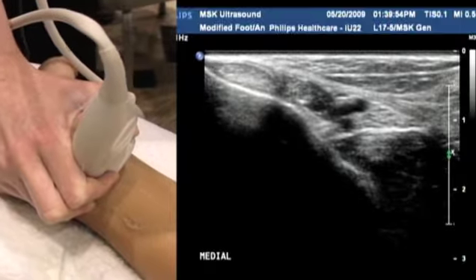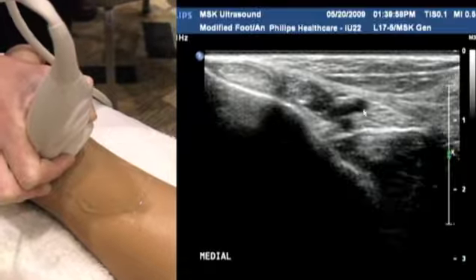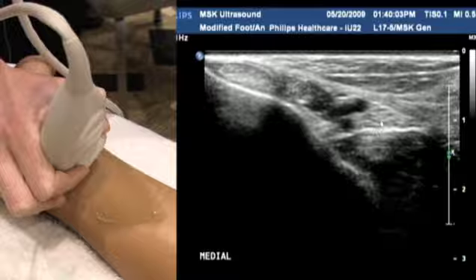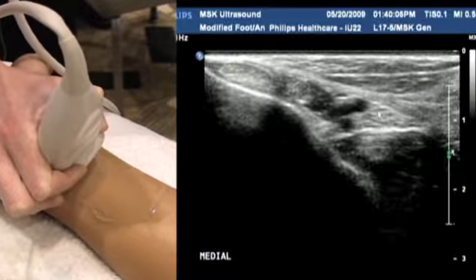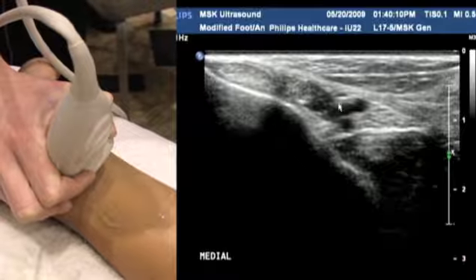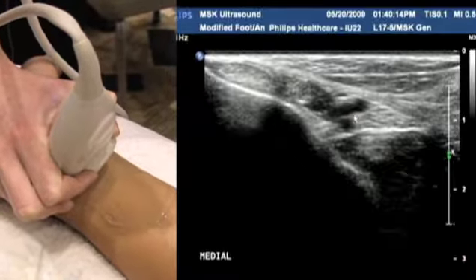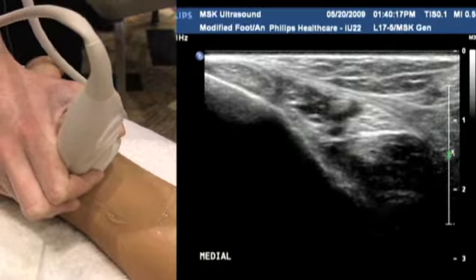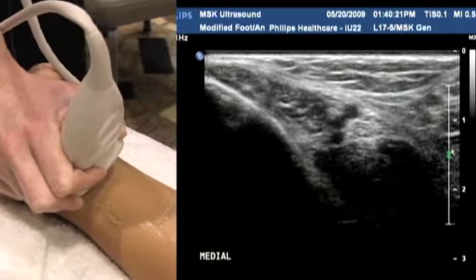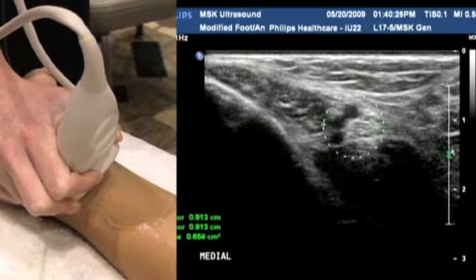In between the tendons, you'll see the tarsal tunnel itself, made up of the posterior tibial nerve with that typical honeycomb appearance of a nerve, with all its punctate hypoechoic spheres in there. You can see the posterior tibial artery, and when we go back to live, you'll see that pulsating away, and the paired posterior tibial veins next to it. So something to be immediately aware of in the medial ankle is that tarsal tunnel complex. Again, let me just highlight where we're looking. This area here.